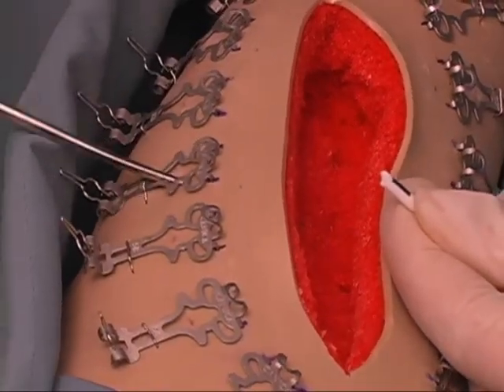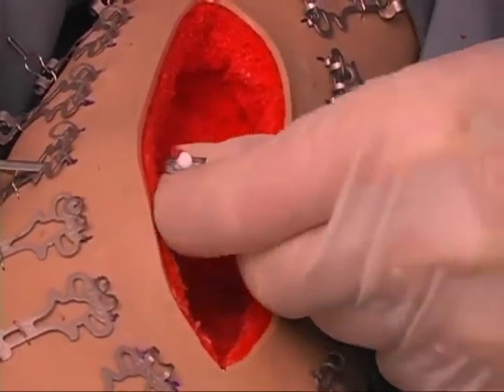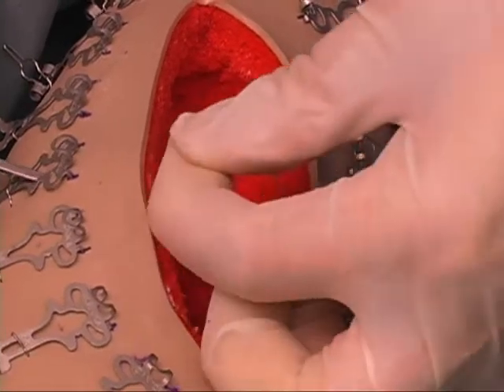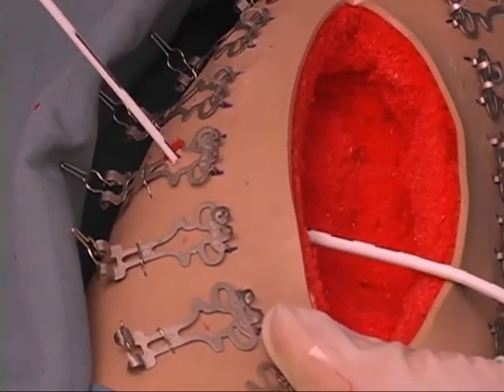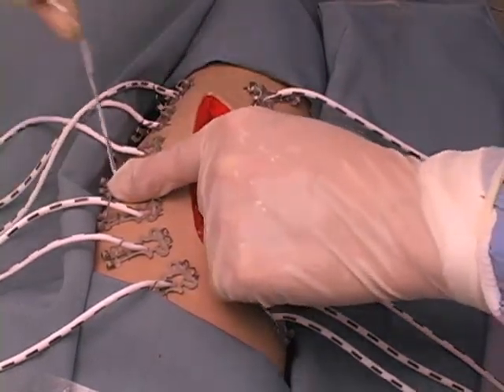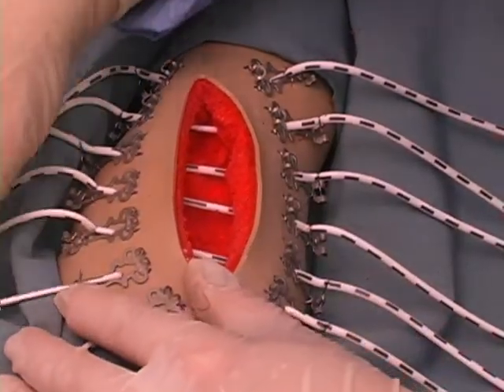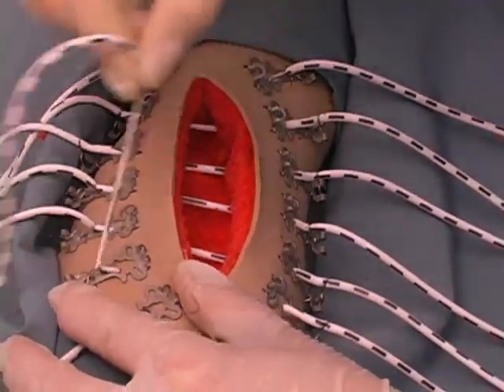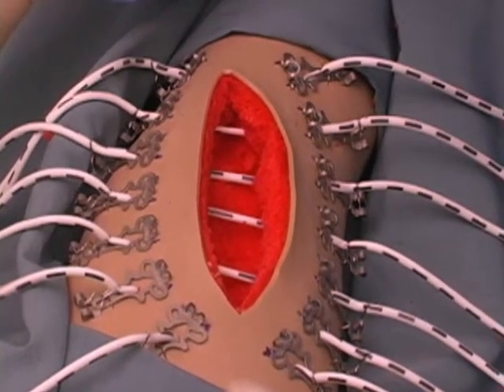Use the loop cannulator as a blunt dissector and to retrieve the end of the elastomer. Pull the elastomer through the skin a minimum of 5 cm. Feed the elastomer end through the eye of the wire cleat and draw to the desired tension. Holding the wire cleat down with one finger, pull the elastomer up to lock. The elastomer can be released and reset repeatedly.